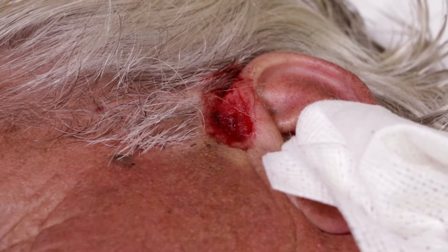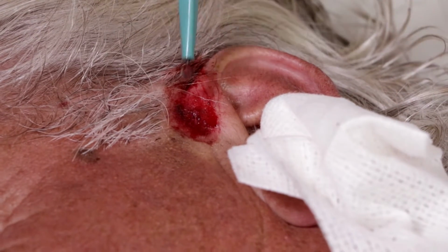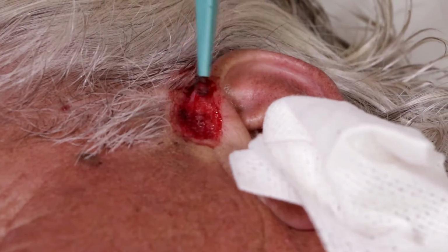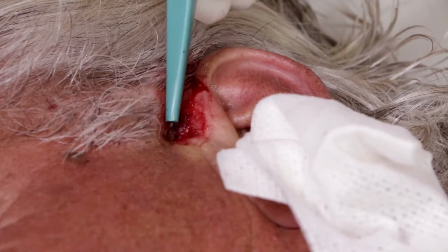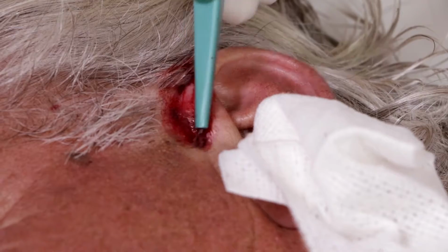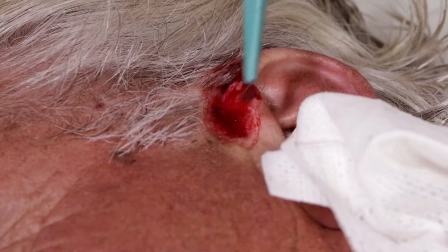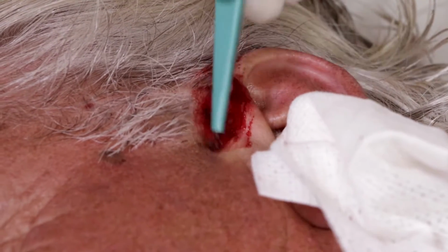See if I can empty it out here. And you use a new tool each time? No, I'm using the same one. Same patient, same lesion, same tool. Gotcha. They're disposable, so I'll throw it away after. Sounds like we're getting a lot right here. It's not bleeding heavily, but of course we have epinephrine in place to help keep it from bleeding a lot.